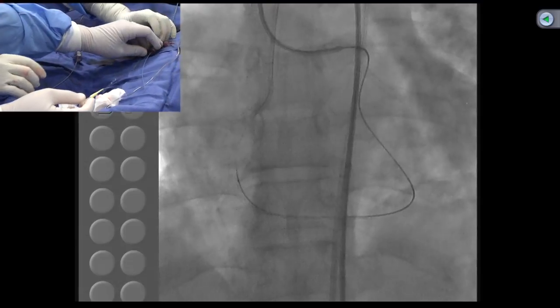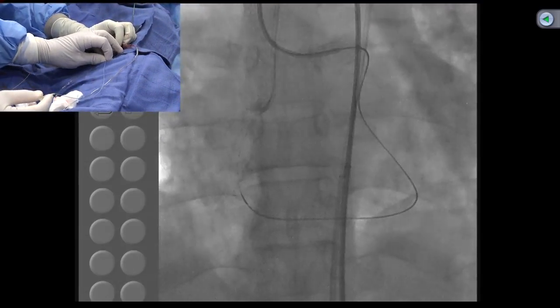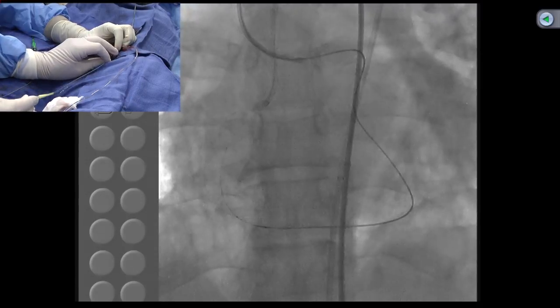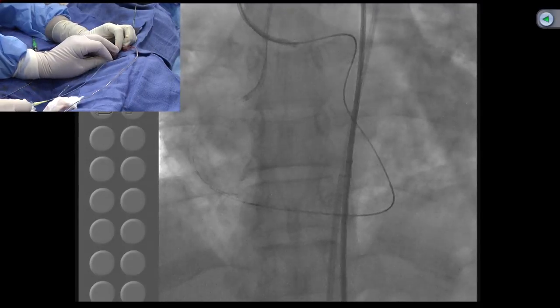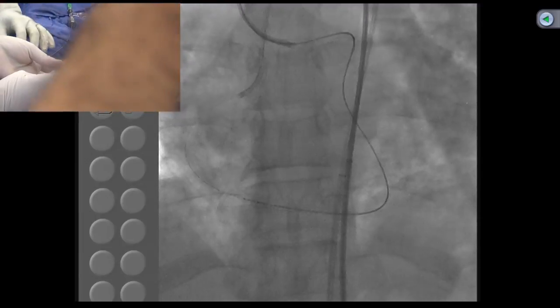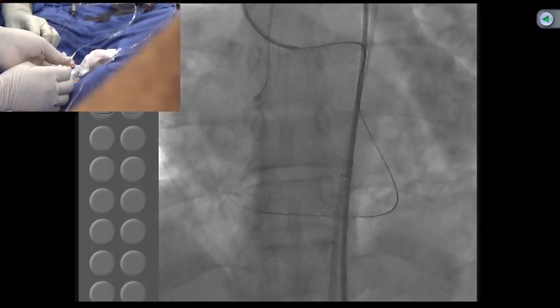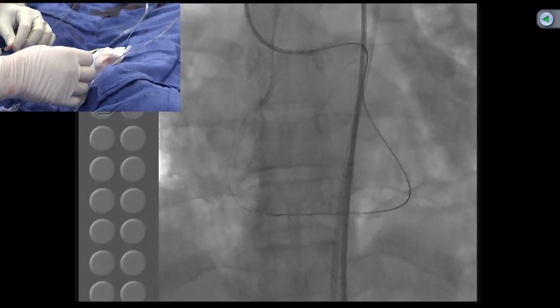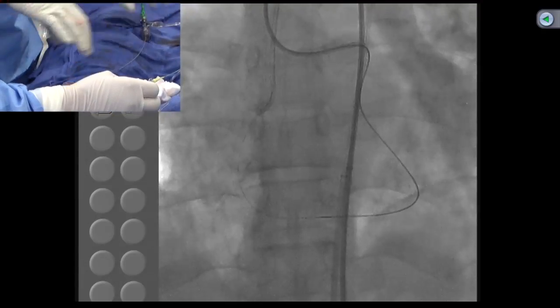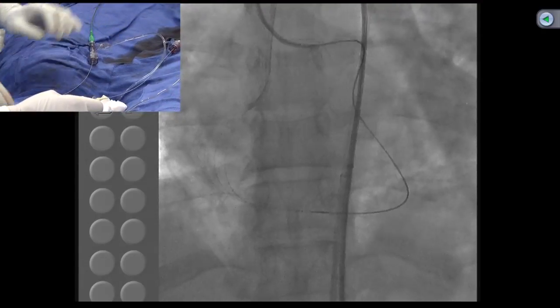Routine use of side hole catheters is a clear overkill. In fact, you'll just end up giving so much more dye. The only thing is that it causes spasm. Okay, wait. Oh, good. Now see the wire has come out, right? Yeah. Good. Particularly for the right, I'm very much impressed by the spasm the right catheter creates. So that routine only for the right I'm talking about.